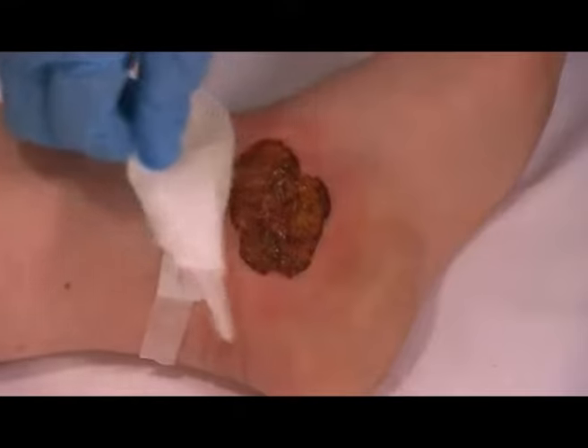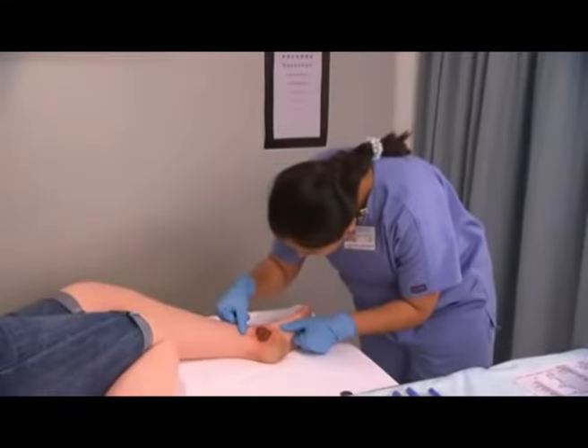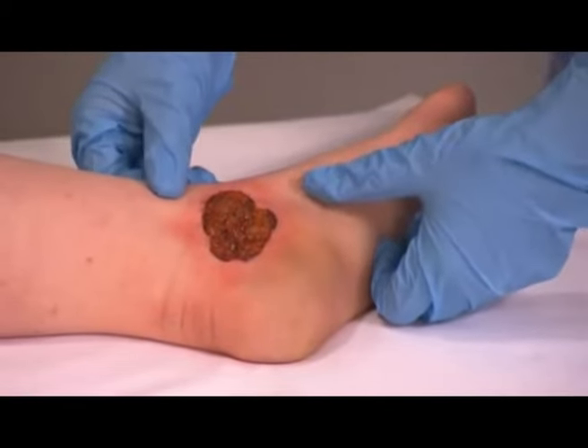Remove and discard any dressing. Inspect the wound. Note the color, odor, and the presence of any exudates.